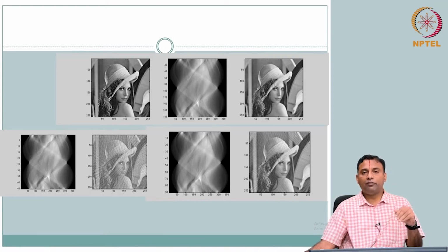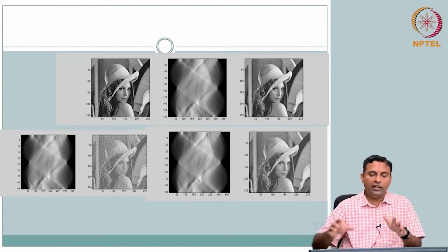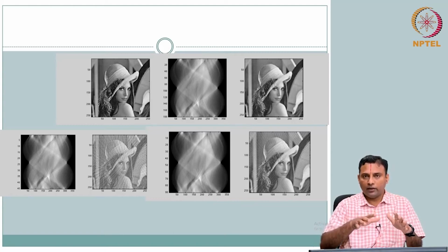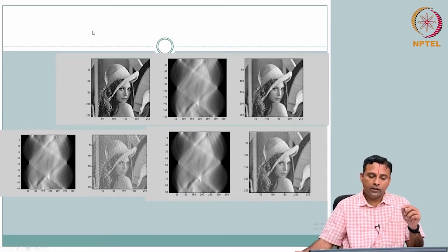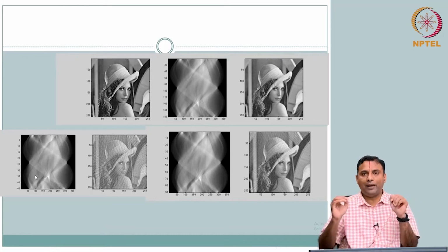So we need to move on to fan beam. We will not do the exact derivation, we will not go step by step like we did for parallel ray projection. For fan beam, we understand the instrumentation, right? We talked about the physics. So we know why a fan beam is employed, and we now know the physics: the reconstruction is along the line you take and you back project. So here you back project and the back projections are all parallel. So what happens if it is a fan beam? It is not going to be parallel.